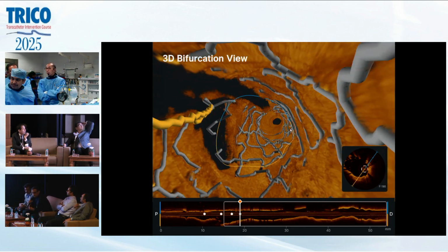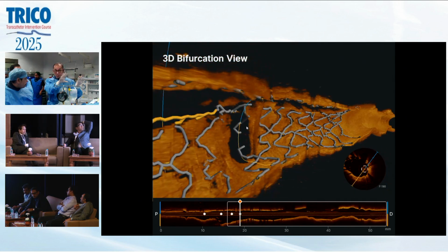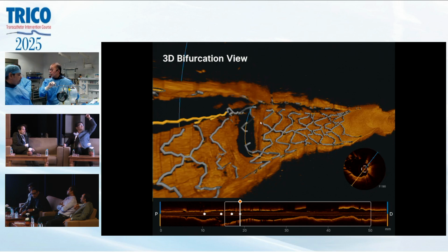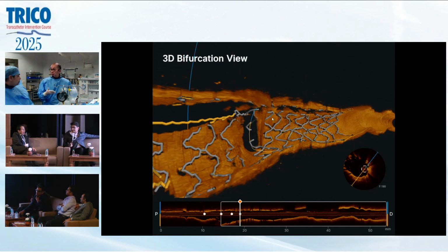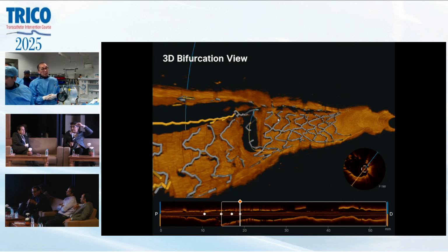Now, in this case, we don't have the angio FFR here, right? To do the FFR just by the angiogram. So you don't have to do it here. If you want to do a functional test, we've got to do an iFR or FFR. But in this case, I'm pretty confident.